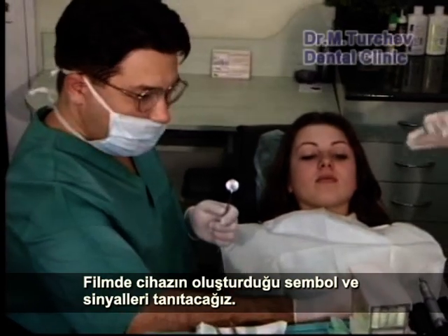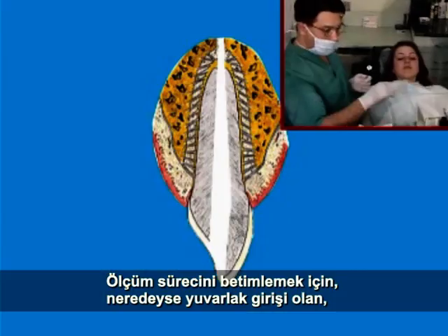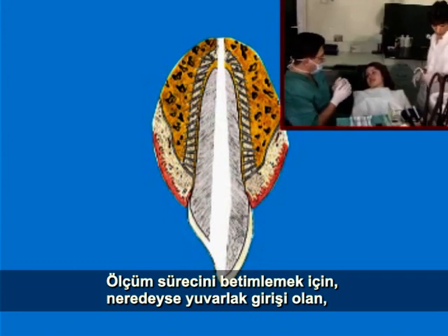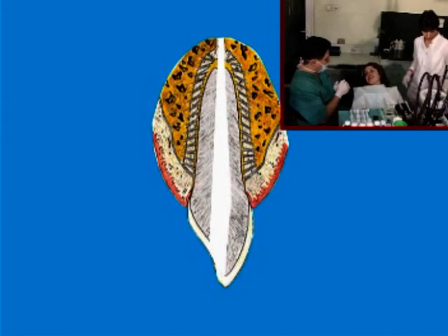In this movie, we will discuss the essence of symbols and signals. To illustrate the process of measurement, let's imagine an idealized root canal with an almost round cross-section, without significant curves, without lateral canals, without apical delta, and with a well-shaped apical constriction.